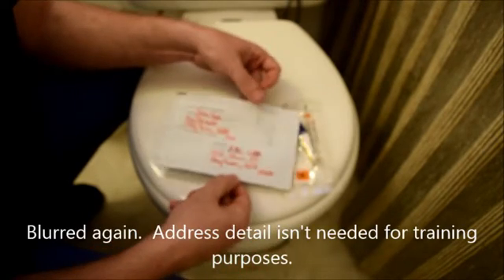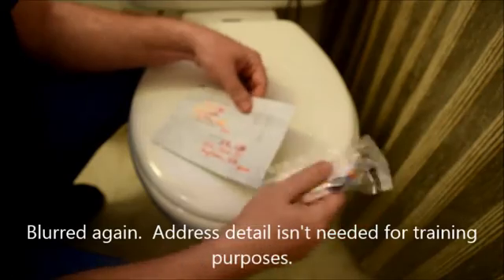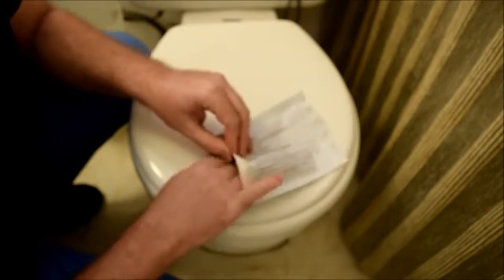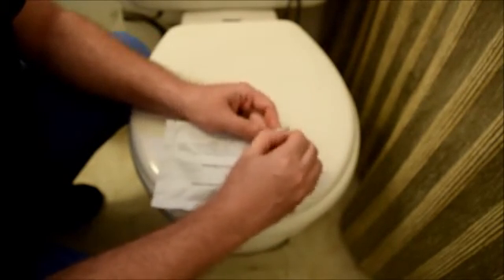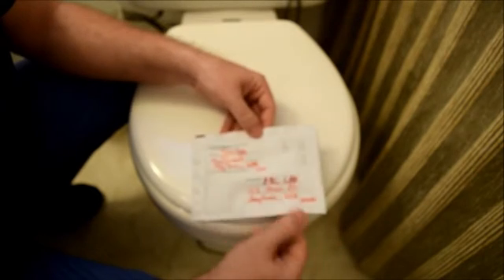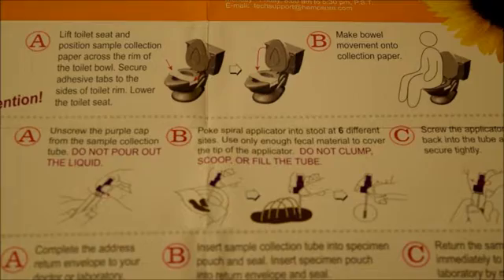Since I was going to mail my sample back to my physician office or lab, I went ahead and filled out the mailer portion before coming into the restroom. Now I'm just going to take the biohazard bag, insert it into the mailer. Again, tear off the back for the adhesive portion and seal the bag. Now I can take this pouch to my local post office to apply the proper postage.